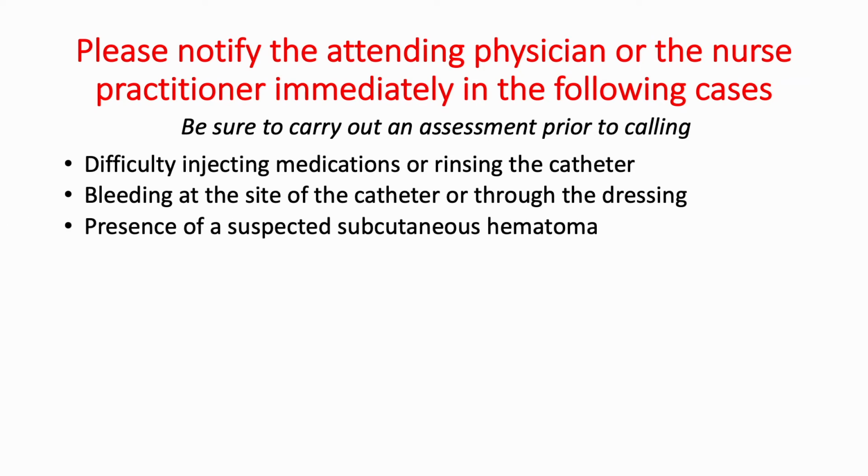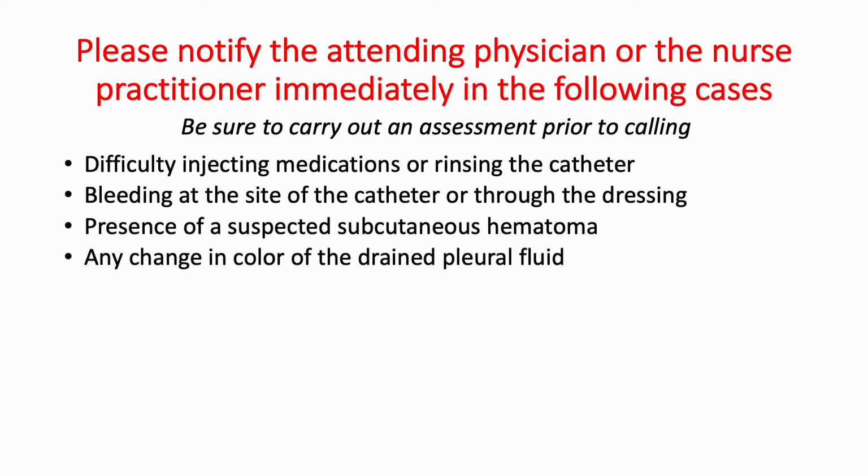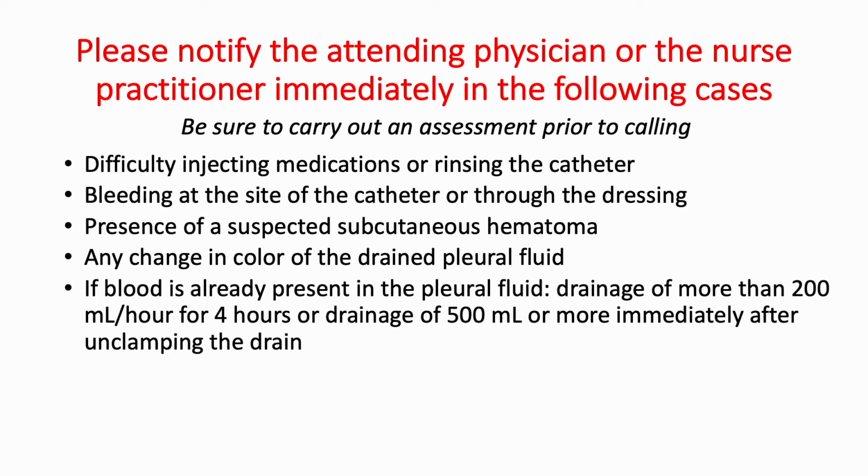presence of a suspected subcutaneous hematoma, any change in color from the drained pleural fluid. If blood is already present in the pleural fluid, drainage of more than 200 milliliters per hour for 4 hours, or drainage of 500 milliliters or more immediately after unclamping the drain.